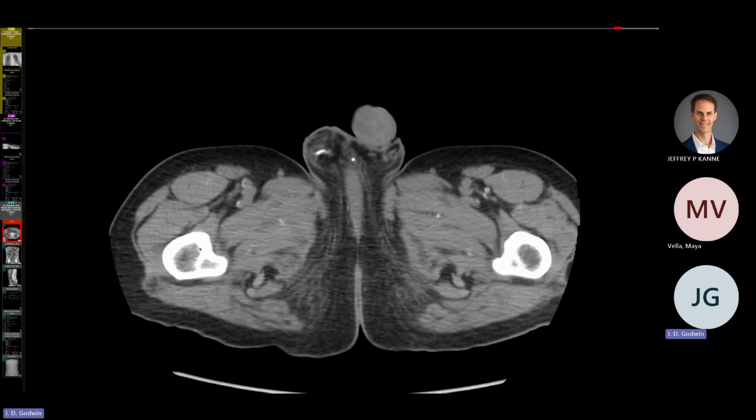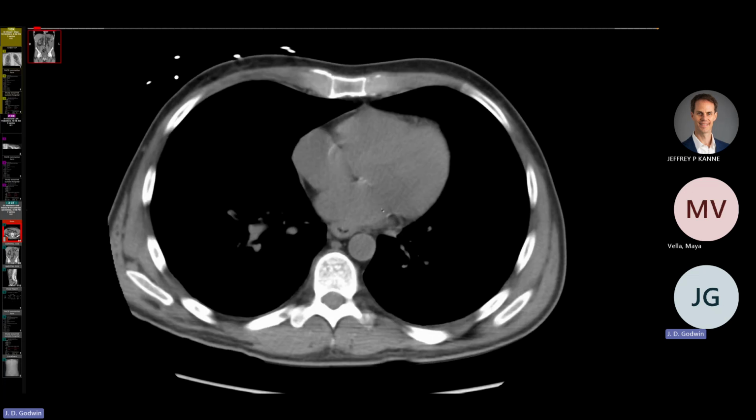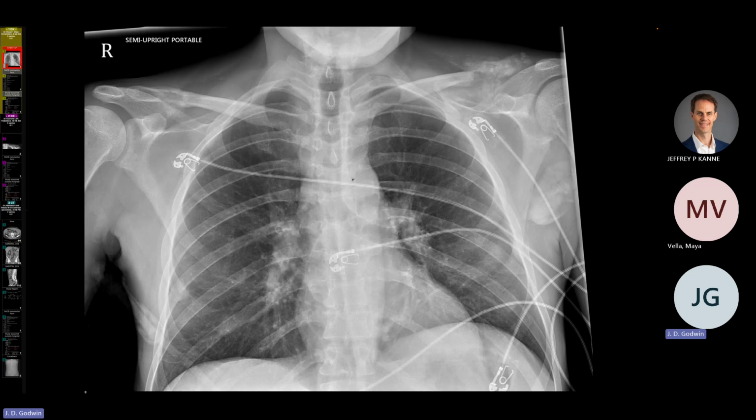Okay. So I wanted to show you this person here who has, at this point, some mitral annulus calcification, okay? And it turns out that wasn't there a couple of years before. This person has a lot of other stuff going on too. So at this point, you can see that there's a destructive lesion here of the distal clavicle on this side. And there seems to be some calcification or heterotopic bone adjacent to it. And there's an earlier lesion actually going on the other side here. Here's a rib lesion down here. This person has chronic renal failure. Okay, and I showed you the abdominal CT that showed some mitral annulus calcification, which you can see faintly down here.